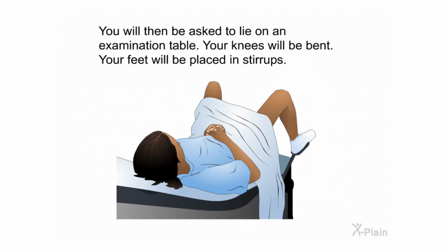You will then be asked to lie on an examination table. Your knees will be bent. Your feet will be placed in stirrups.